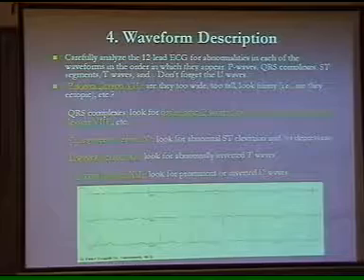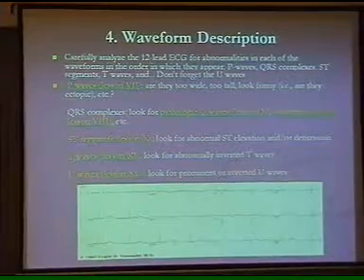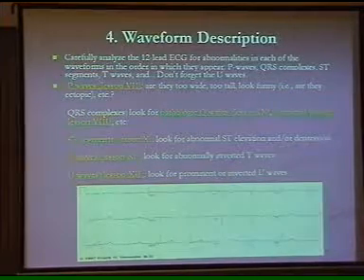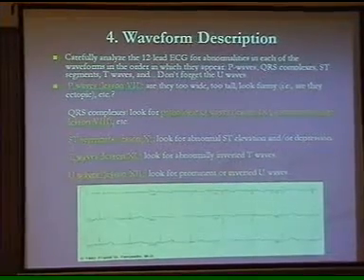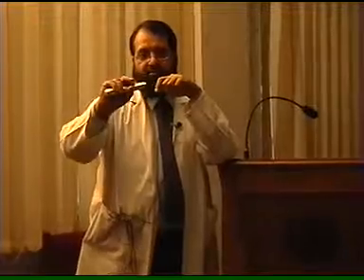I've told you that there are 25 small squares in 1 second. So how many small squares in 1 minute? Times 60. 25 times 60. That is 1500. Right? So if there are 25 small squares in 1 second, the ECG machine is just running the paper at the speed of 25 small squares per second. So in 1 minute you'll get a paper with 1500 small squares.